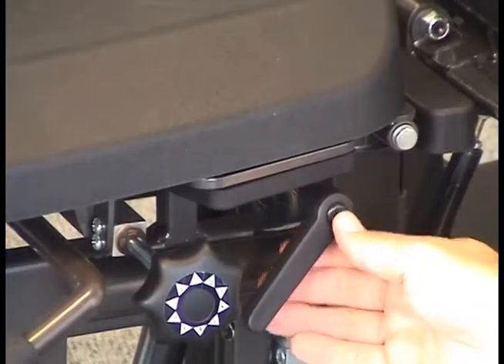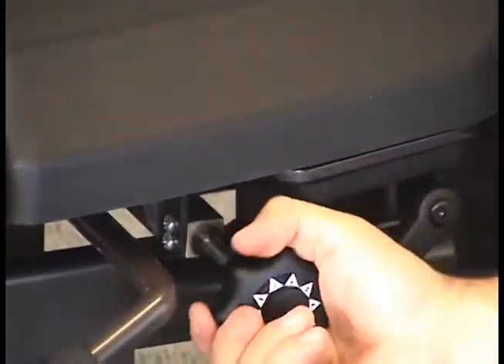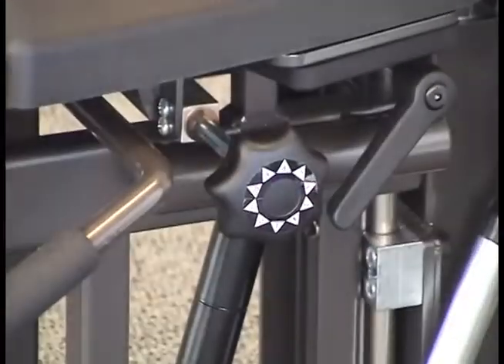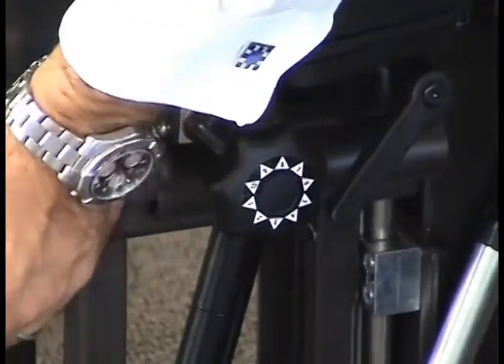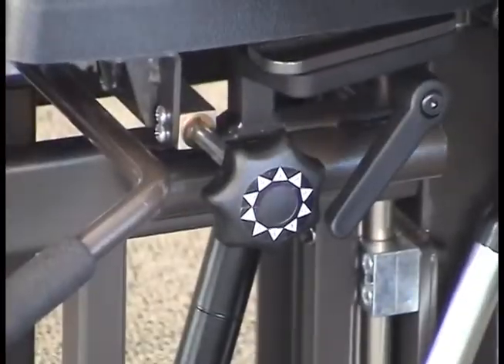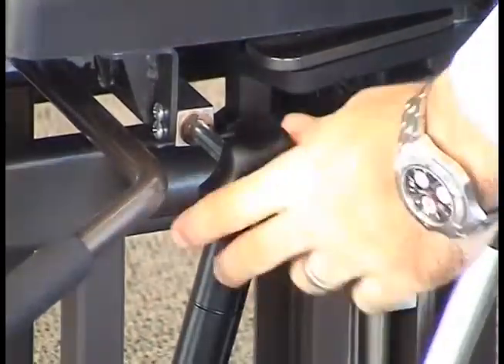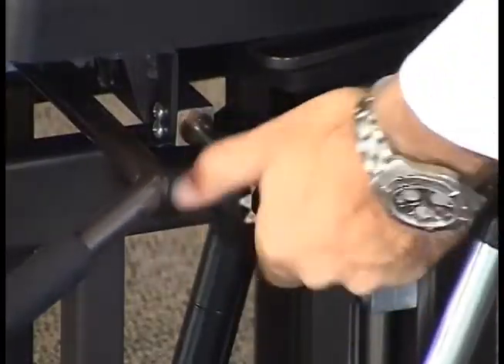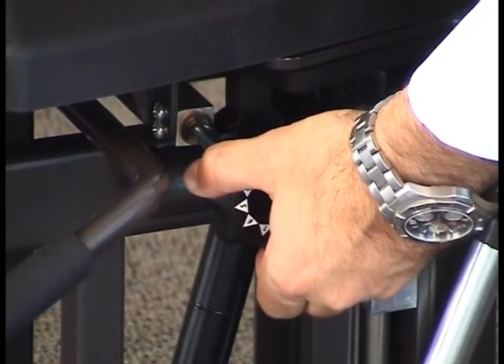When the tension knobs are set to their fullest in the thoracic, lumbar, and pelvic sections, you will probably not be able to drop that section. When the tension knobs are set in their lowest position, the weight of the corresponding piece will drop itself.